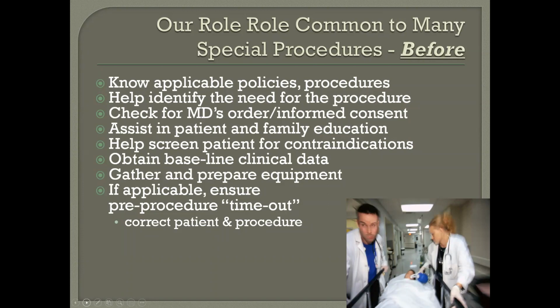The most common complication, as you explain it to the patient, is just a little lowering of the blood oxygen. You don't have to use the term hypoxemia with them; it would probably be inappropriate. That would be treated with just increasing the FiO2, the oxygen concentration. In almost all cases, the patient responds very well, so very few complications. But educating the patient on what's being done, why it's being done, any major potential complications, how those are going to be resolved, and how you're going to find out the result. Who's going to communicate, how, what they found and or what wasn't found.